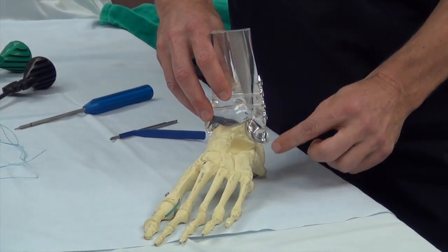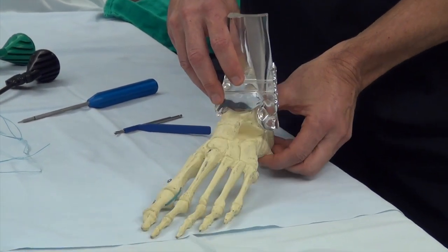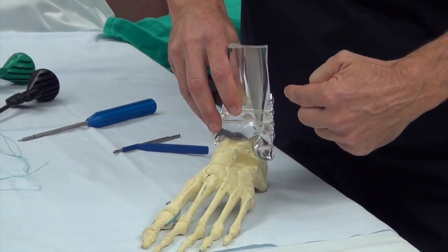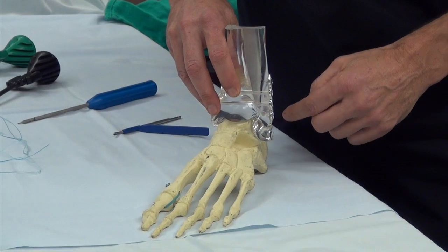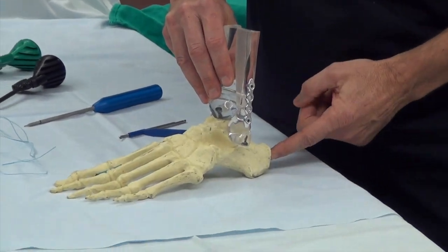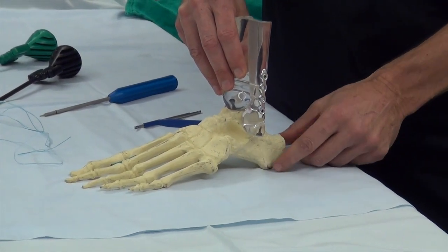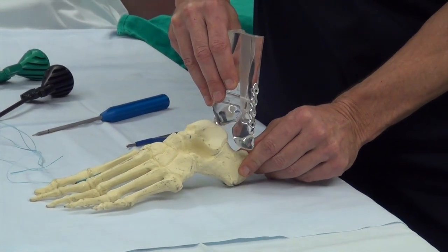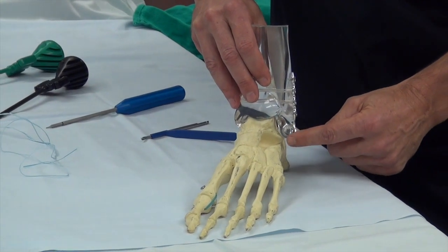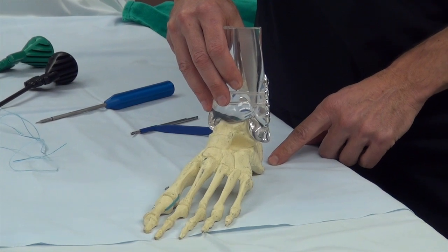There are three ligaments. Two usually get torn in the quintessential inversion sprain, where the ankle inverts this way. More importantly, the one that holds the foot back — we perform a test called the anterior drawer test in the office where we pull at the back of the heel. If it's actually torn, you'll pull the foot out of the joint this way. We confirm it on MRI and repair this ligament, the anterior talofibular ligament, with the modified Broström procedure.